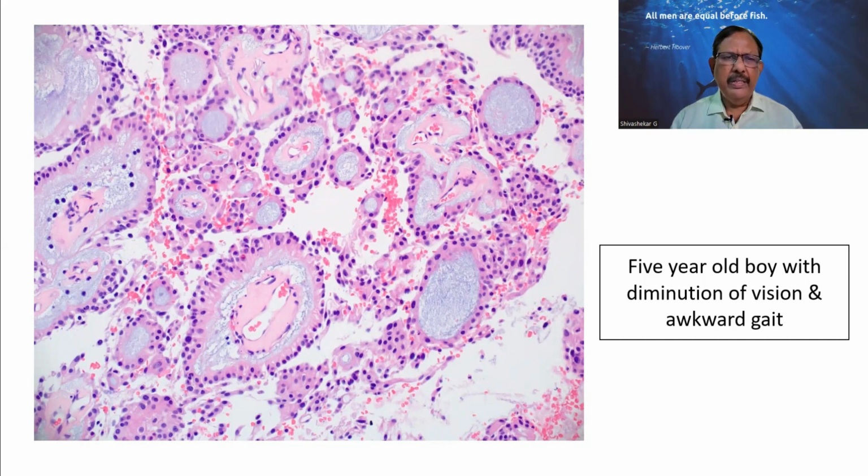Diagnosis comes last. If not at all, fine. But pattern matters most. Now in this case, I am finding multiple circular structures, and in the middle there is a blood vessel, which means it is a papillary structure.